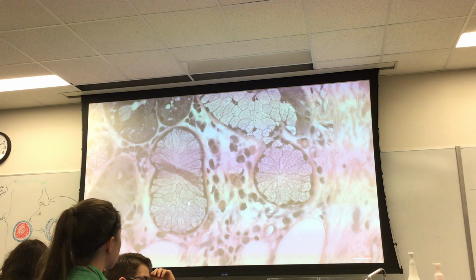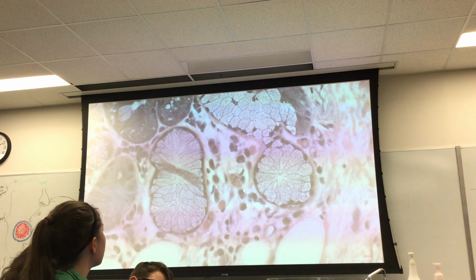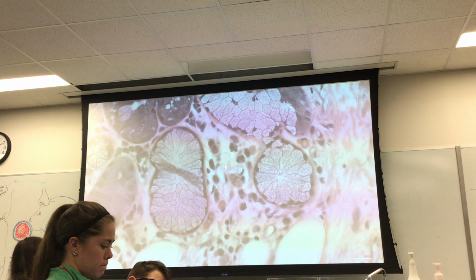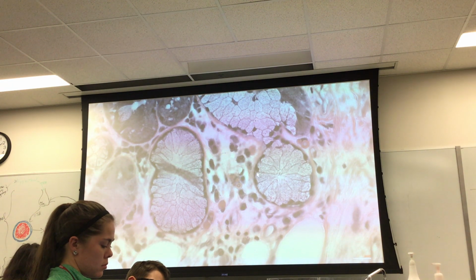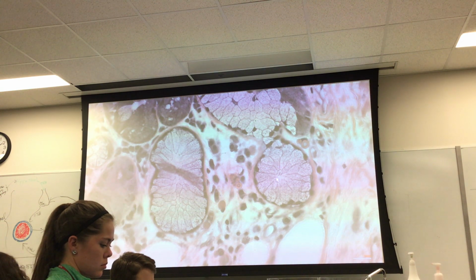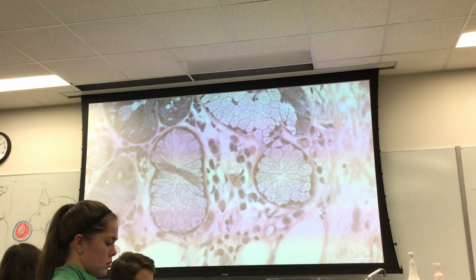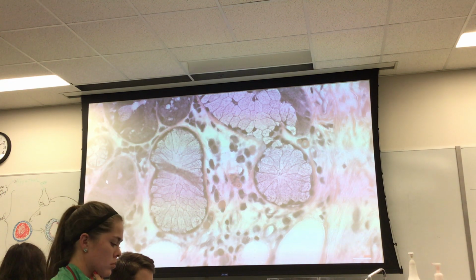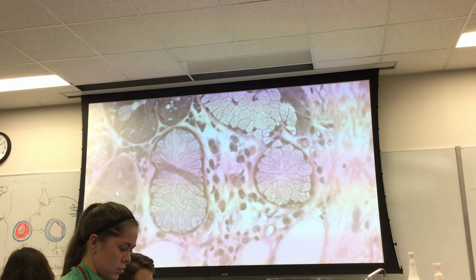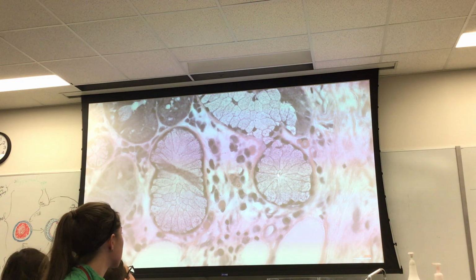That's a gland. So, remember glands, we said there's serous acinus, mucus acinus, or the combination mucus acinus with the serous demilune. Which one's that, mucus or serous? That's mucus. Again, what's the difference? Basally placed nuclei, very dark, light staining cytoplasm, as opposed to this one, dark cytoplasm, nuclei aren't as flat, and in some sections, depending on the staining, they can look pretty light staining as well. So this is the serous look, this is the mucus look.